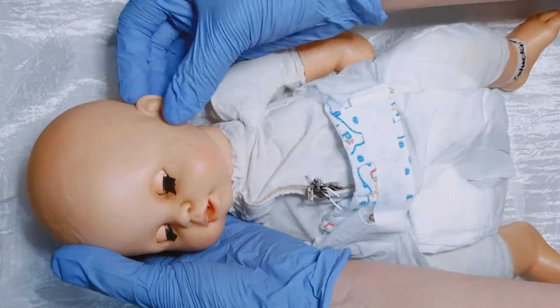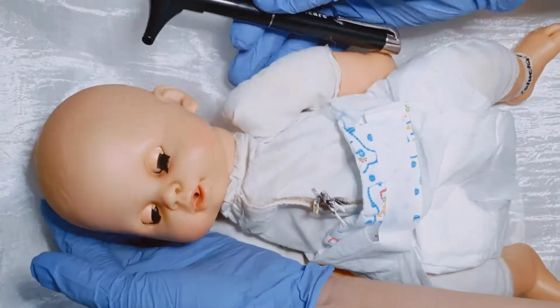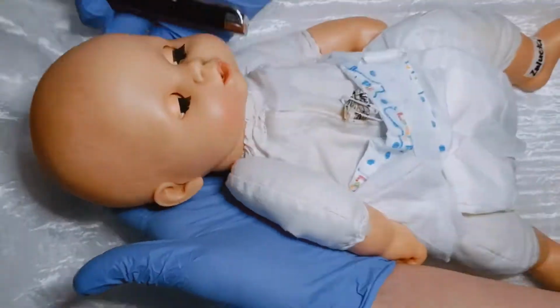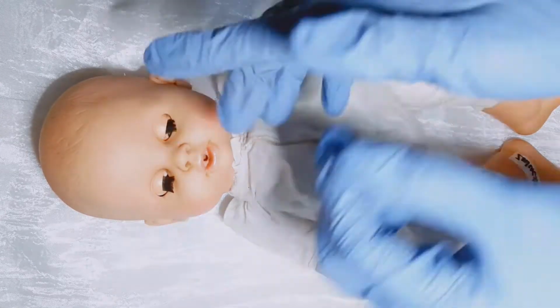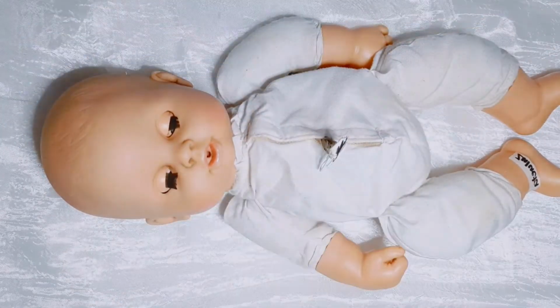Next is to inspect the newborn's external ear, skin condition, and skin tag, and we can also inspect the internal ear by using the otoscope. Now we have to inspect the appearance of the nose and test for choanal atresia, and of course the internal part of the nose by using the penlight, and note for any distress with breathing.